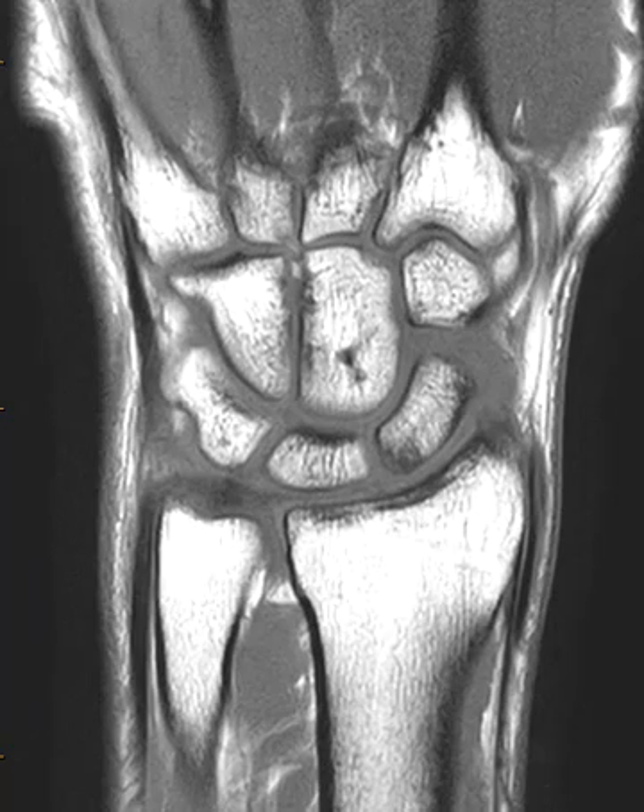Hello, this is Dr. Gay from FirstLake MRI. This is a 30-year-old mixed martial artist who injured their wrist recently. X-rays were normal.